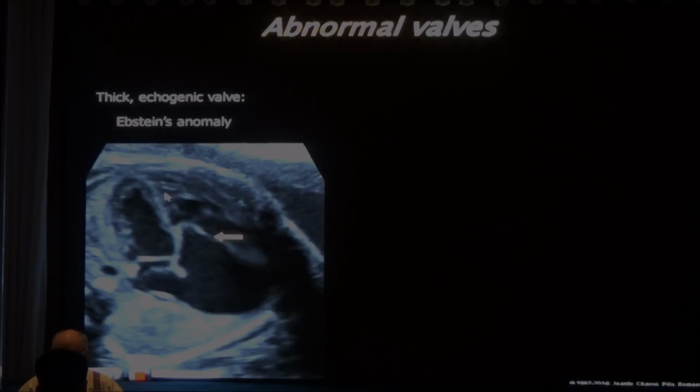And actually, this is an Ebstein anomaly, and you can see that with color Doppler. In tricuspid dysplasia, you will have regurgitation from the middle of this chamber here, which is the right ventricle. But in Ebstein anomaly, this is the atrialized portion of the right ventricle, all that. The right ventricle is just a tiny slit at the apex over here. So this is Ebstein anomaly with massive regurgitation.